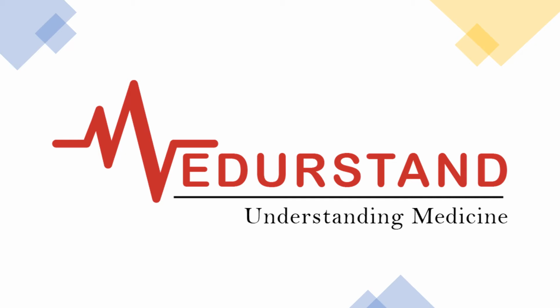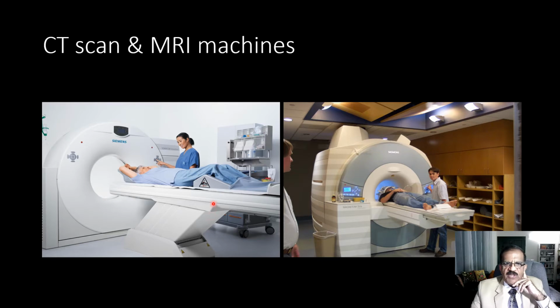Understanding Medicine. I am Professor Aziz-ur-Rehman, and after completing 4 modules on X-ray chest, we are going to discuss the role of CT scan and MRI in the diagnosis of common conditions which can be diagnosed by an internist also.